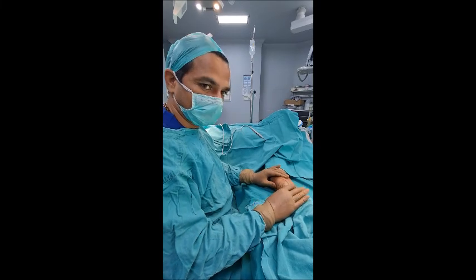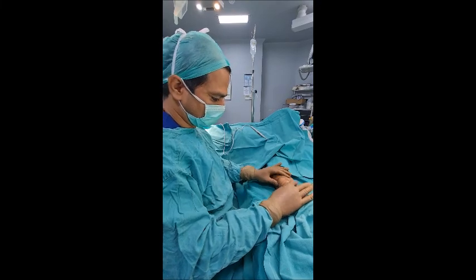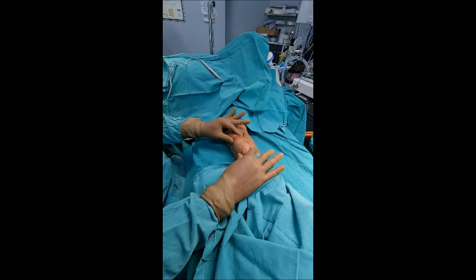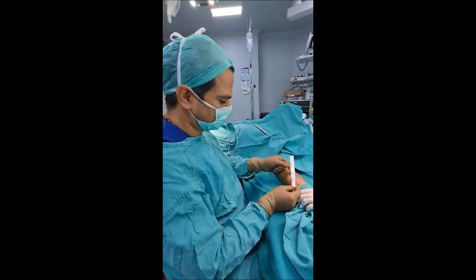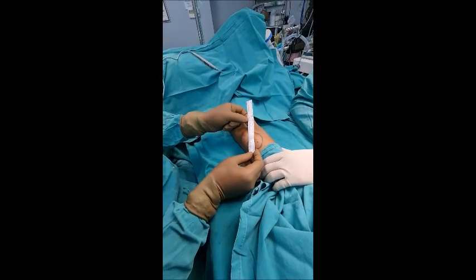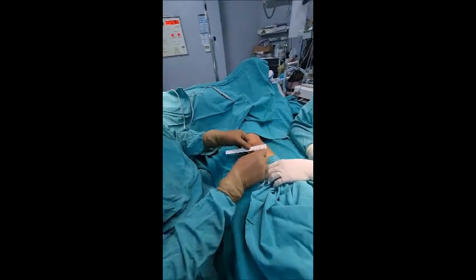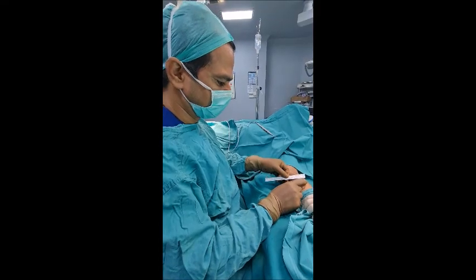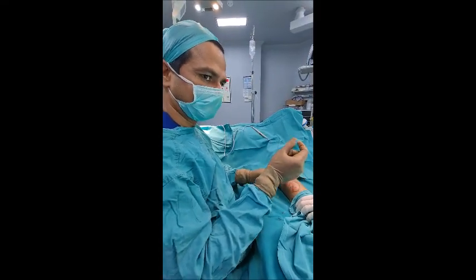This big lipoma can be completely removed with the help of our minimal invasive technique. You can see this big lipoma here — the patient has multiple other lipomas also. When we measure this lipoma clearly, one dimension is around 9.5 cm or around 10 cm, and the other dimension is approximately 6 cm plus. This complete big lipoma can be removed through a very small hole, which is maximum 3 to 5 mm.